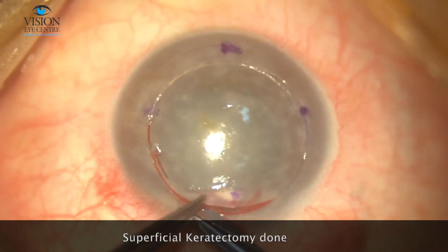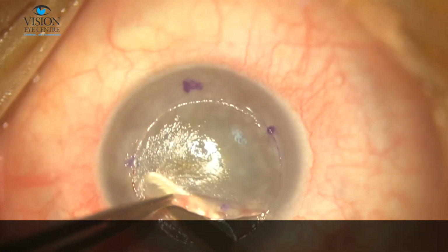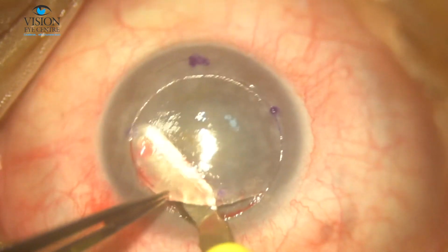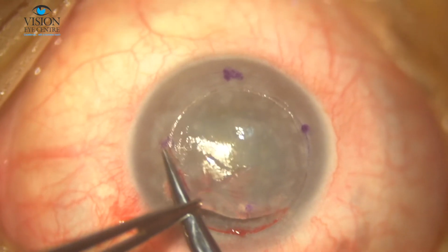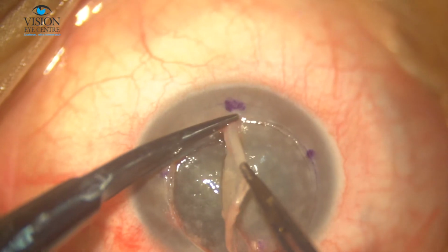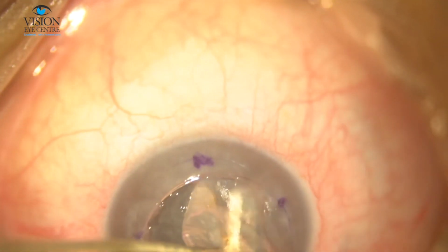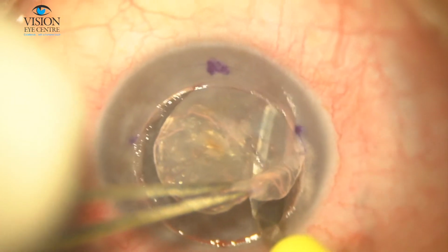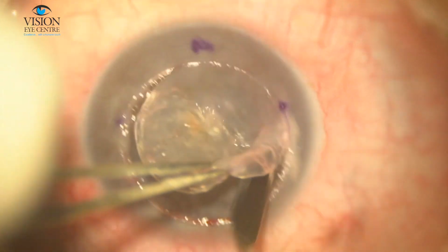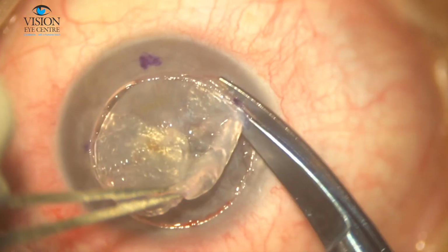So this is a case of DALK being performed in a patient with macular dystrophy. Superficial keratectomy is being done, as I perform in almost all the cases. So we dissect about half of the corneal thickness, and the anterior stroma is excised using a crescent blade and regular scissors. This helps us get to a plane where we are able to finally attempt the big bubble.